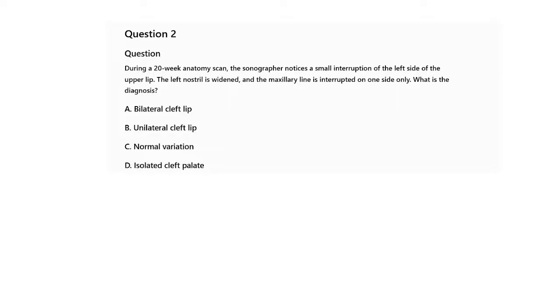A. Bilateral cleft lip. B. Unilateral cleft lip. C. Normal variation. D. Isolated cleft palate. What is the correct answer?